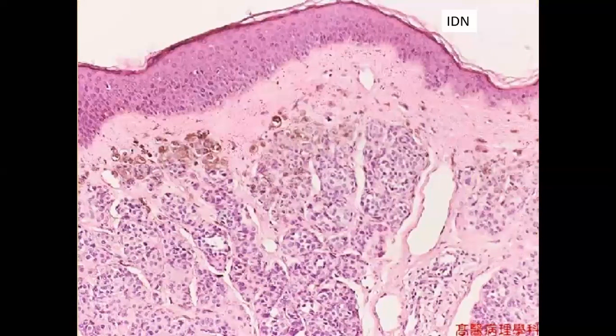So among the melanocytic tumors, the benign one is the intradermal nevus, a very common tumor which is seen in the examinations as well. This tumor comprises benign looking nests of melanocytes within the dermis. There is a Grenz zone and there is no junctional activity. If there is junctional activity as well, then it will not be called an intradermal nevus, it will be called a compound nevus. So for intradermal nevus, there should be no junctional activity, there will be a Grenz zone, and then nests of benign looking melanocytes. The superficial nests of melanocytes will have pigmentation, while the deeper nests mostly do not have any pigmentation.